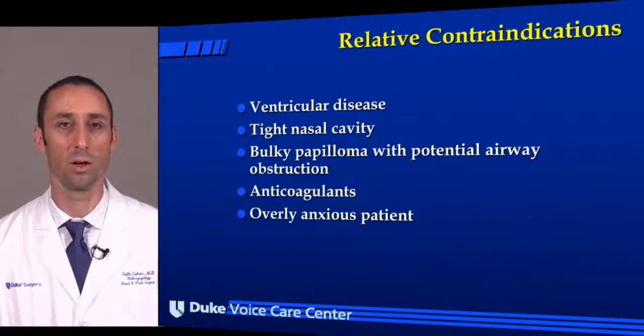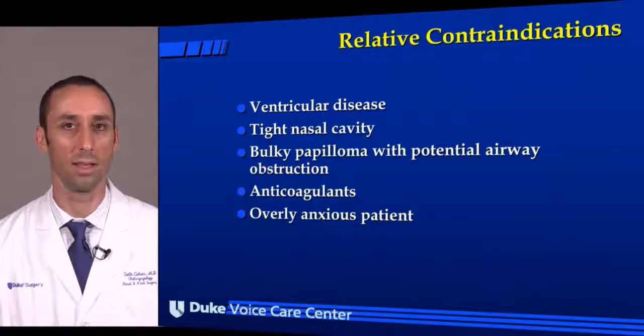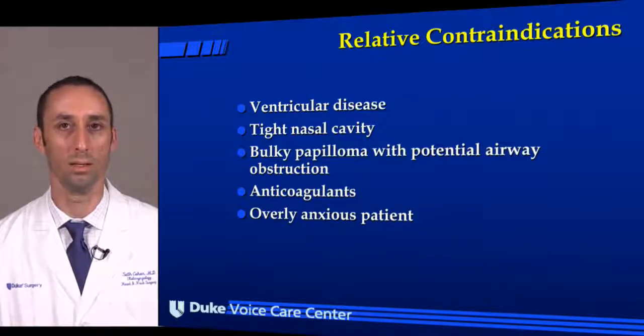Somebody who's very anxious is not going to tolerate you taking away their laryngeal sensation. And you have to reassure the patient that they can swallow, they can breathe, and you're monitoring both the entire time that you're with the patient, because they're going to feel like they cannot once you take away their sensation. So if a patient cannot tolerate it, because of their anxiety, or if they have COPD or whatever comorbid condition, if you're concerned that taking away their sensation will be an adverse problem for that patient, then you want to not do that.